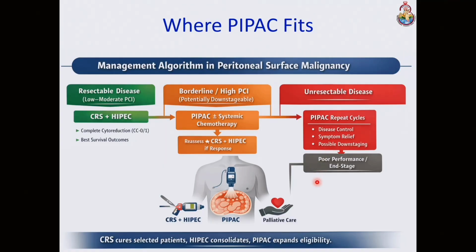So with this, in some time, I will show you from the theater how the CapnoPen actually works.